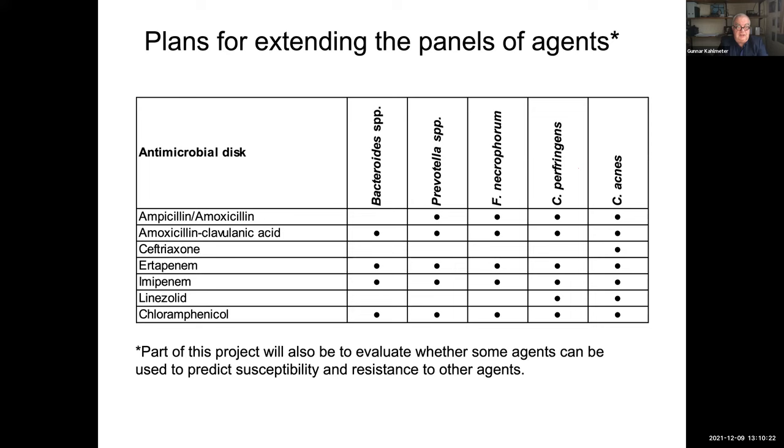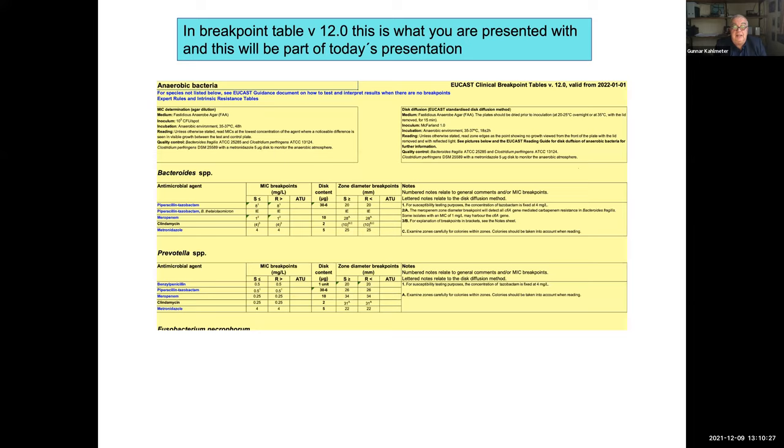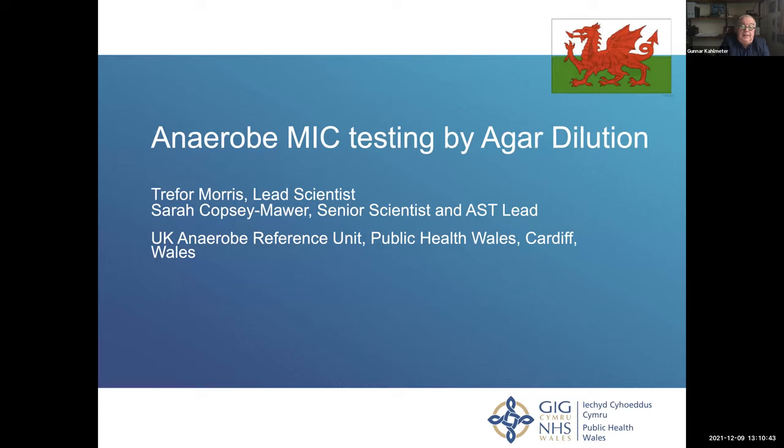This is what the table is going to look like. You can already now see it in Breakpoint Table 12, which is on the website for consultation. And Erica will go through it in a little bit more detail later on. So with that, I will hand over to Trevor to talk about anaerobic MIC testing by agar dilution. Take it away, Trevor.